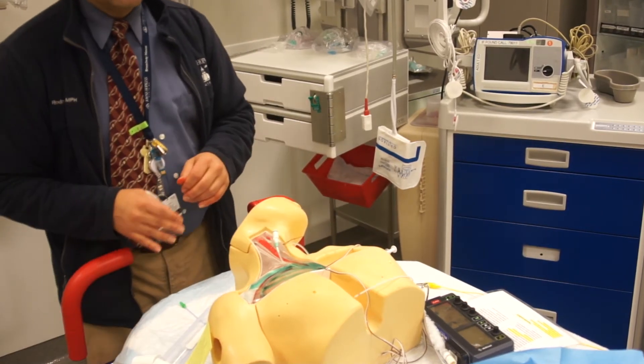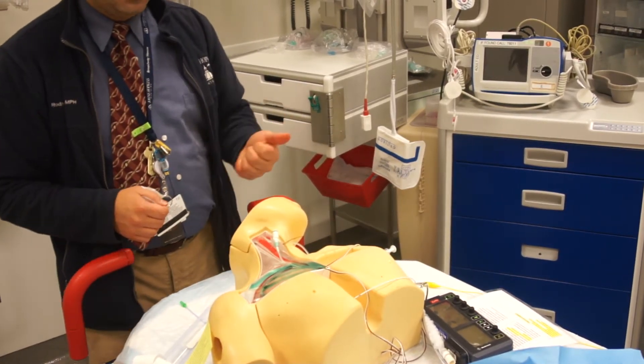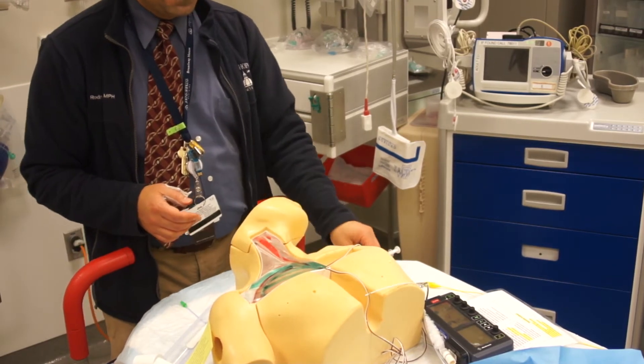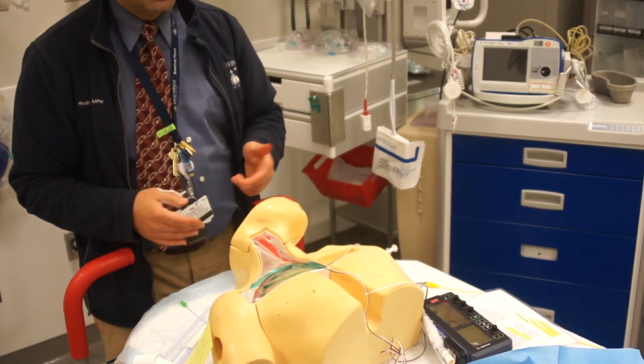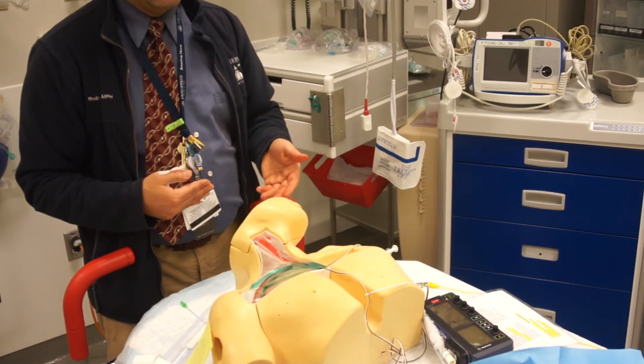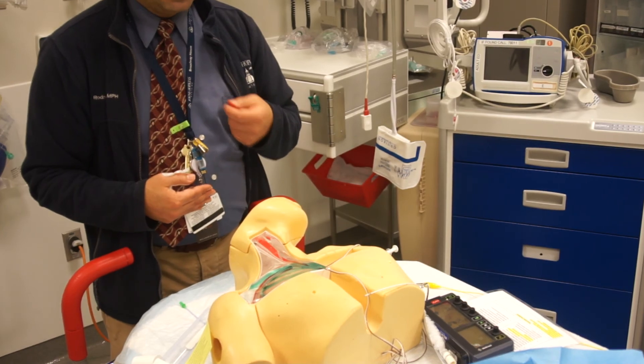So that's the last lesson. In summary: lesson one was getting used to all the equipment, lesson two was learning to deflate the balloon, and lesson three was to inflate the balloon and advance it.